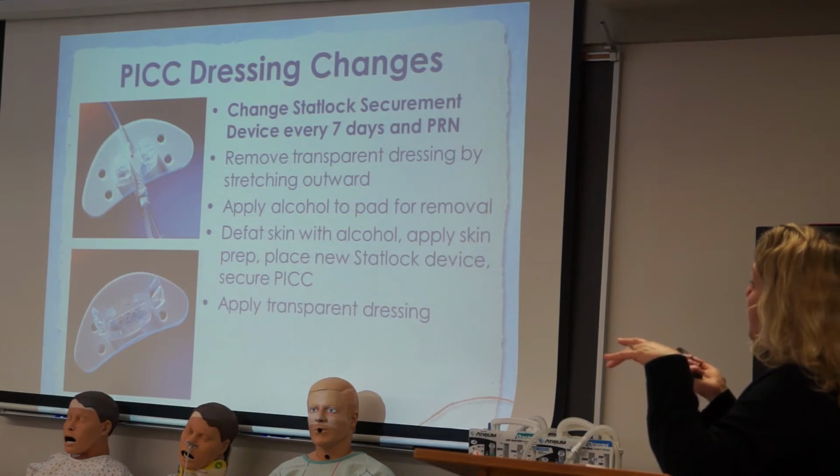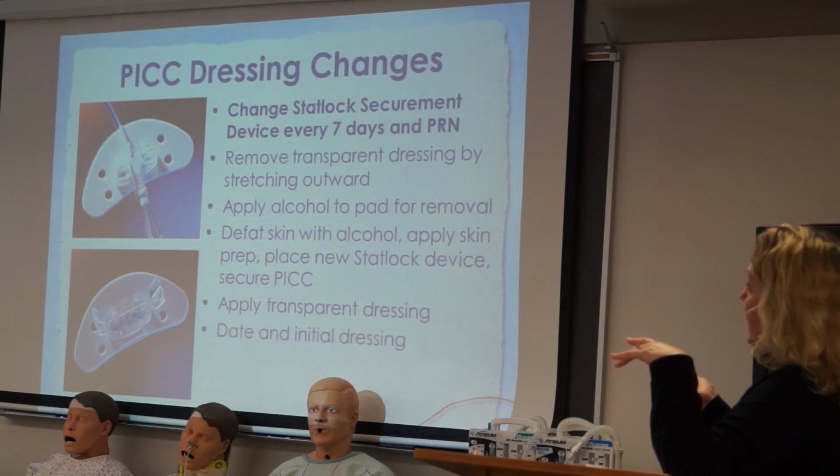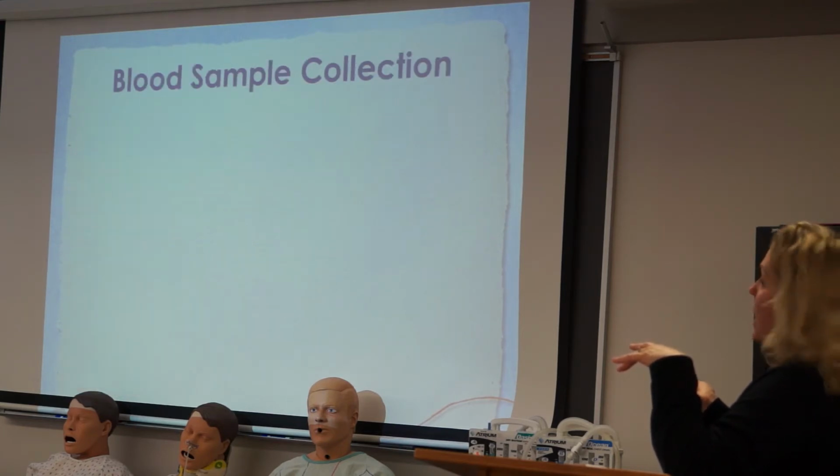A lot of places are using biopatches on PICC lines now as well at the insertion site, so be aware of that. And again, date and initial, so the next person knows when the last time that dressing change was made. And then again, last thing, always document it.